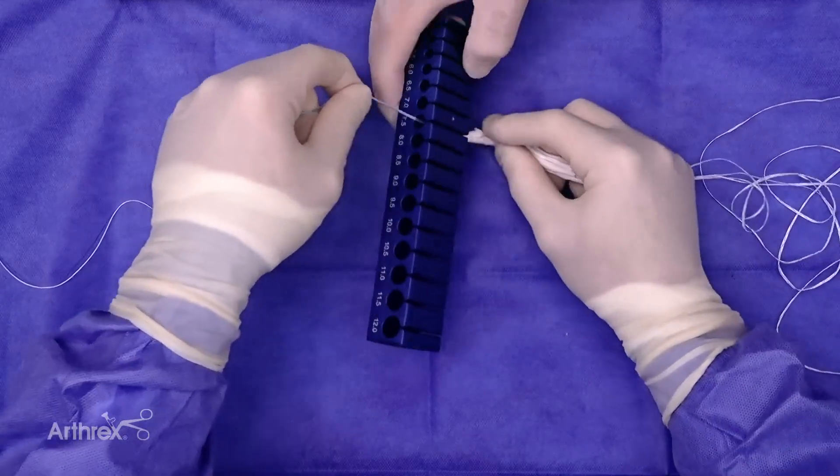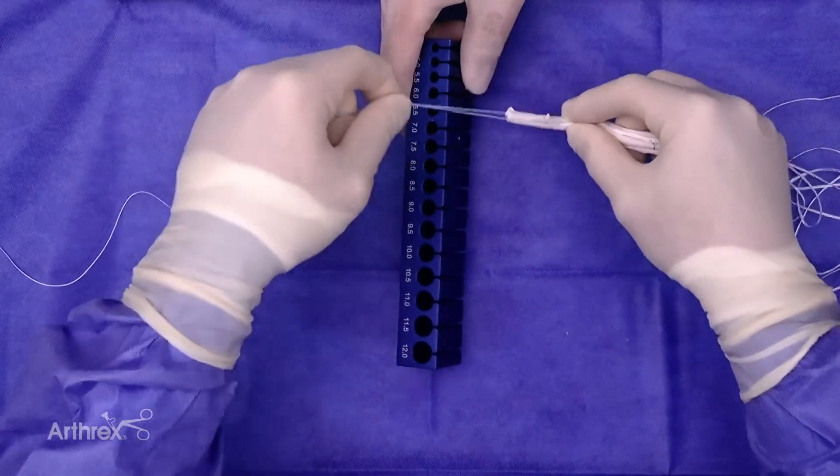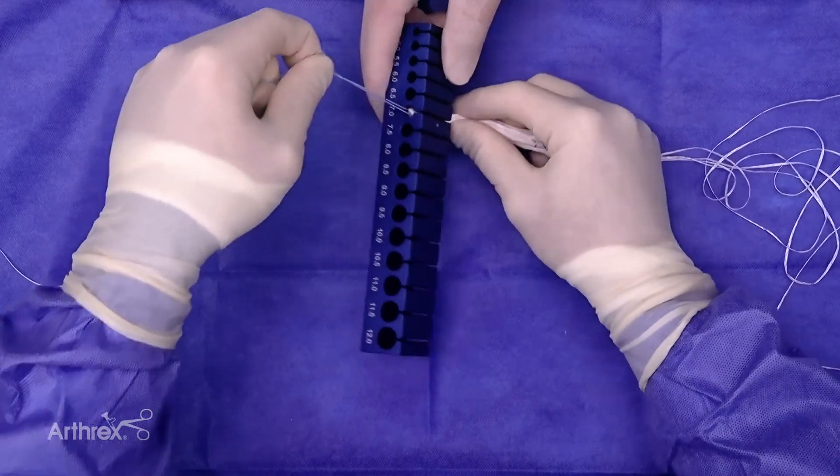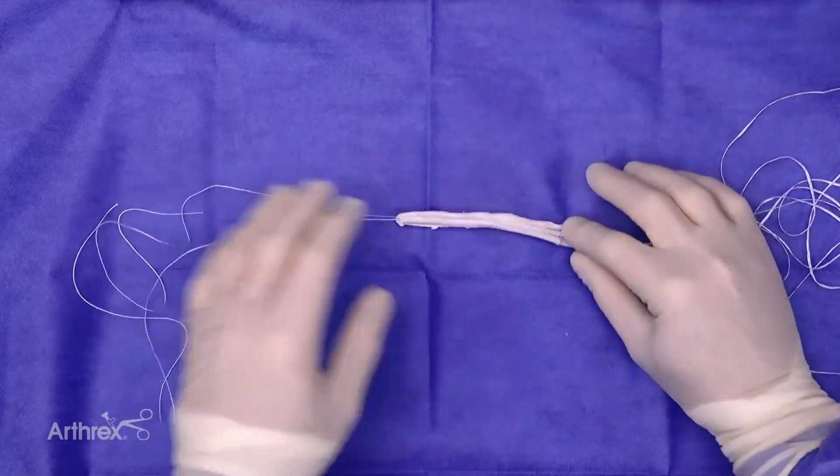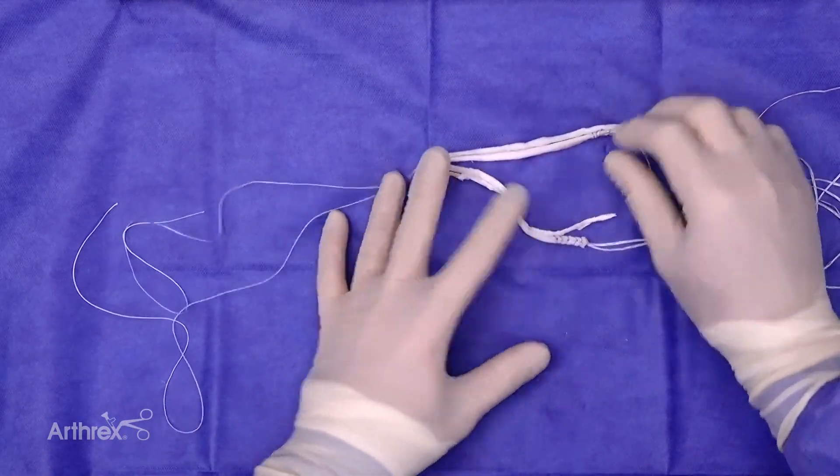An easy pass through 8, easy pass through 7.5, and starting to get tight at 7. So the re-rupture rates at that time, based on multiple prior studies, demonstrate high re-rupture rates.